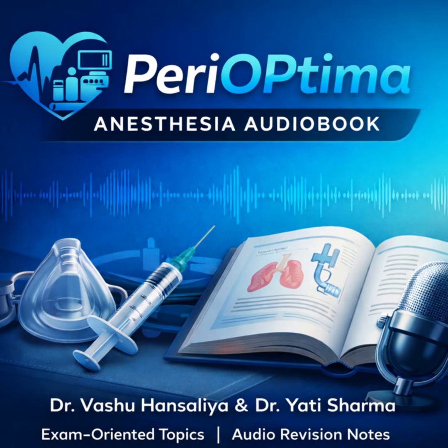So why do we need all these different types? What's the clinical relevance of having this whole arsenal of tools? This is the so what question, and it's vital. The fundamental takeaway is that there is absolutely no single standard laryngoscope that works for every patient. It's not one size fits all. Not at all. The choice is always multifactorial. It depends on the reason you're doing it. Is it a routine case or a known difficult airway?